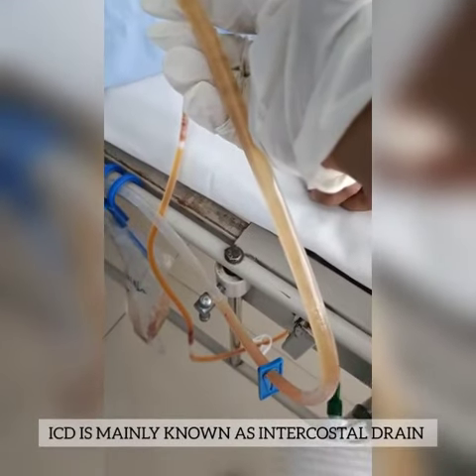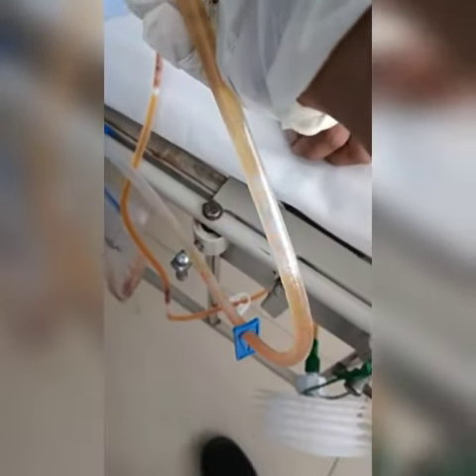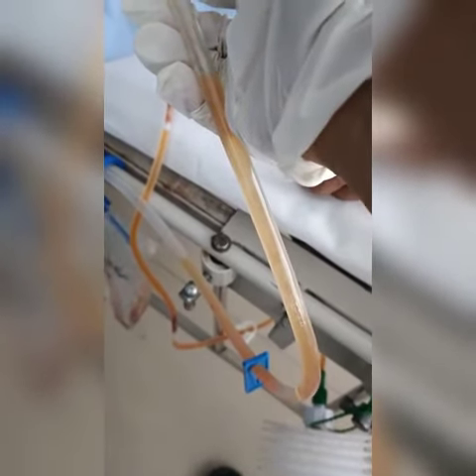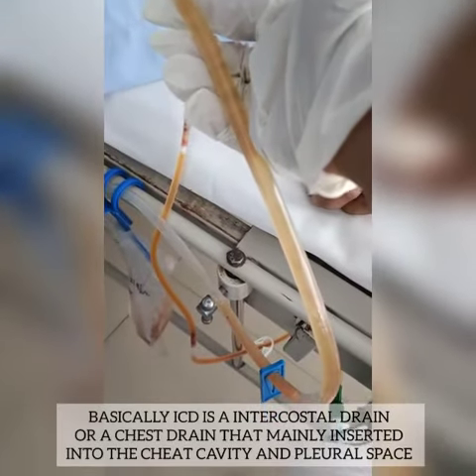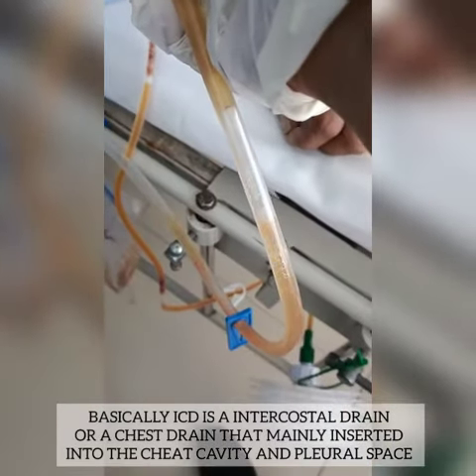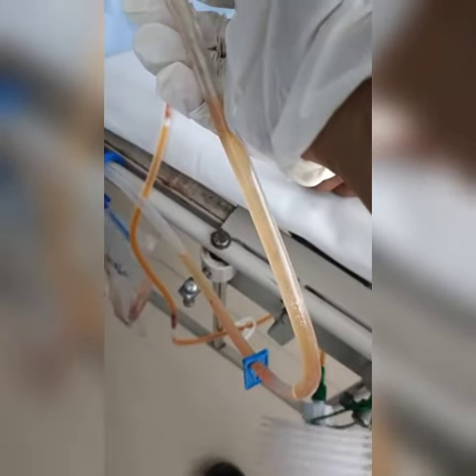In this video we are going to check the presence of column movement in the ICD drain. ICD is an intercostal drain or chest drain, which is mainly inserted into the chest cavity or into the pleural space.